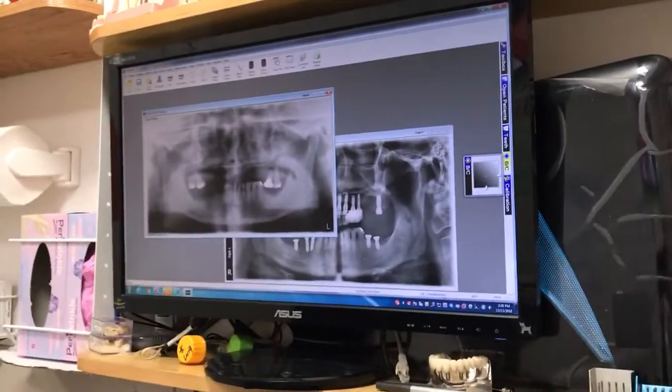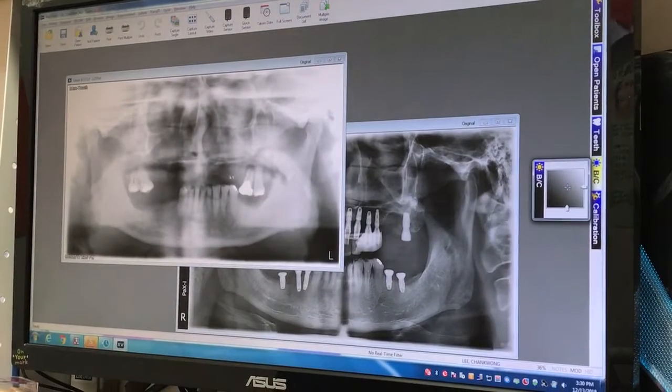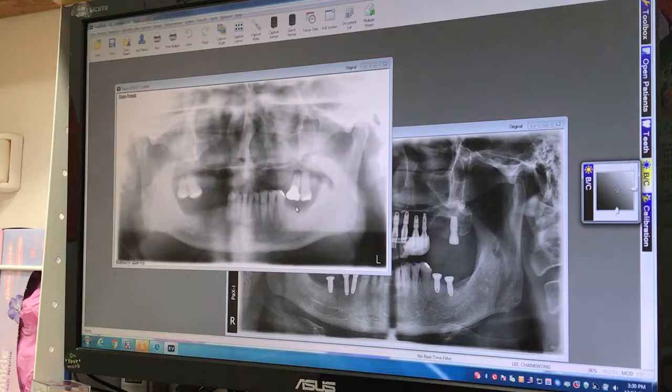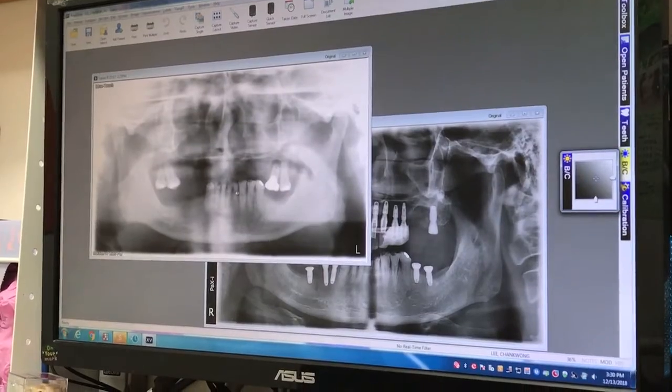Hi guys, today we are starting an upper full arch implant. Our patient came in with just four teeth remaining on the upper arch. He was feeling very uncomfortable when he was wearing the partial denture, so he wanted to get implants.